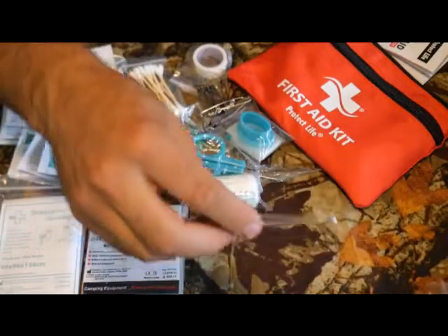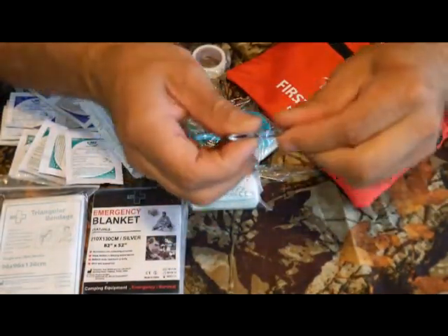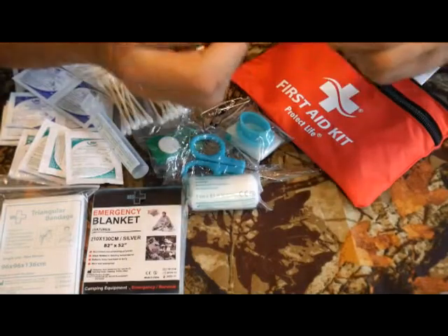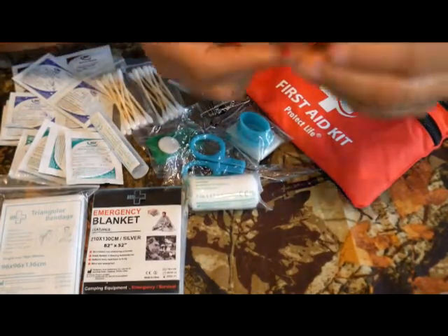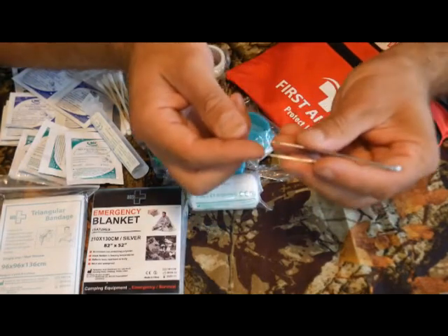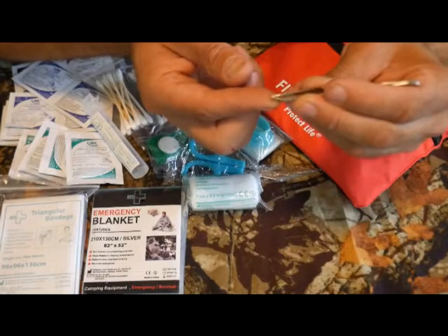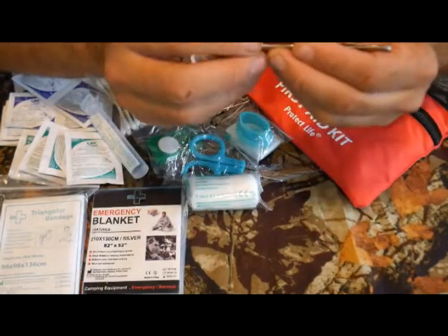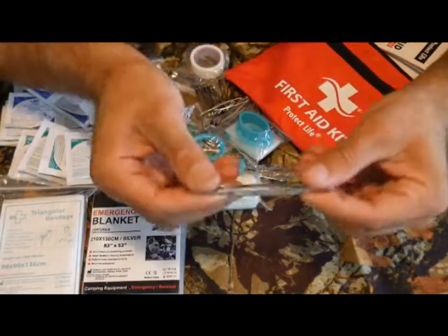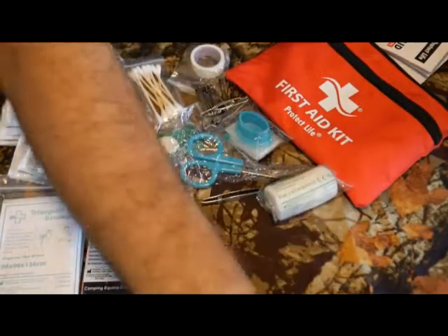Another pet peeve of mine is tweezers — most first aid kits come with really junky ones that aren't sharp enough to get anything out. These actually seem like better quality; they're actually sharp on the end and might be able to grab splinters, shards of glass, or pieces of metal. I may not need to replace these tweezers. Pleasantly surprised.